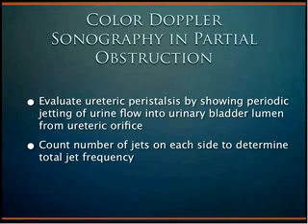Color Doppler can be used to evaluate for ureteric peristalsis by showing periodic jetting of urine flow into the urinary bladder lumen from the ureteric orifice. You count the number of jets on each side to determine the total jet frequency.